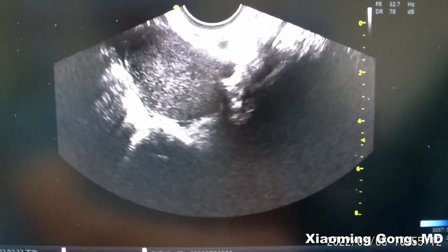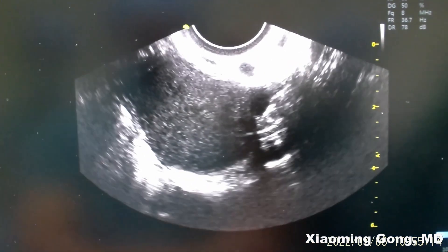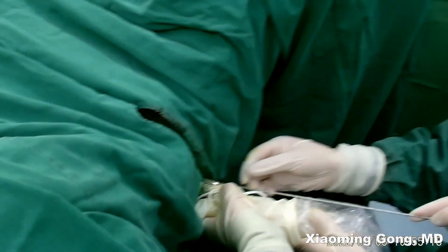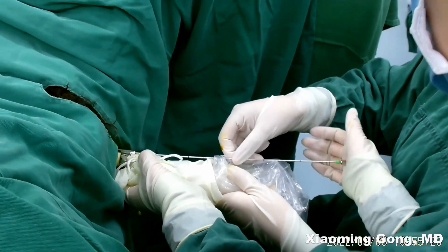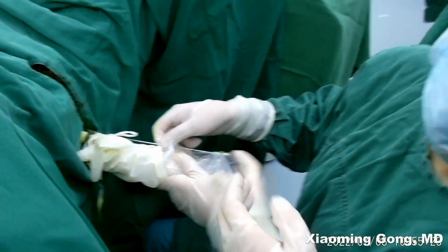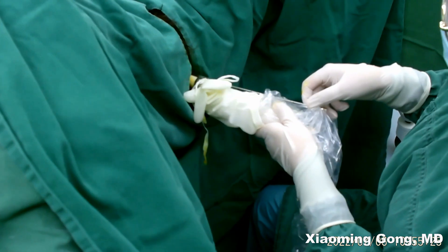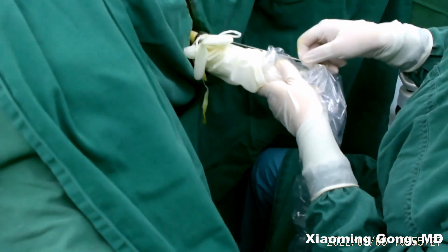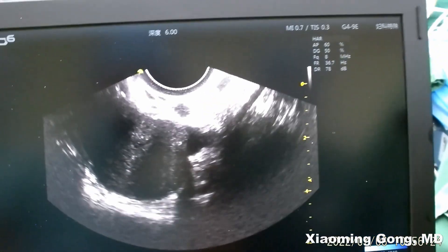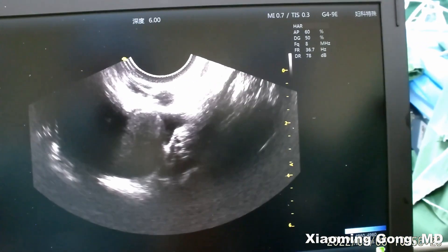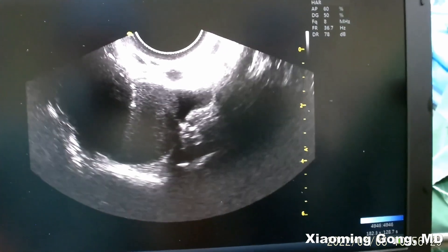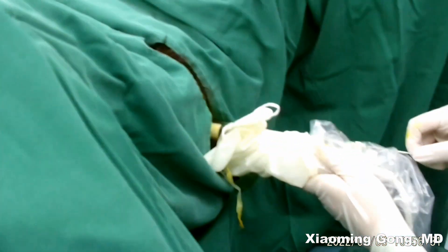This procedure is suitable for ovarian cysts such as a chocolate cyst or a serous tumor. We use a 16-gauge long needle to puncture the cyst.